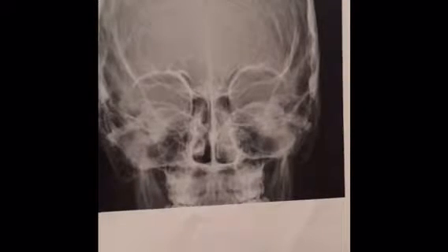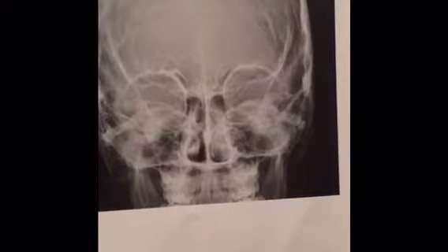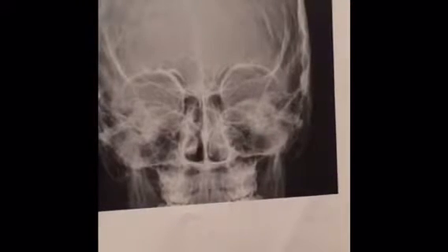The petrous ridge symmetric on both sides. The mid-sagittal plane of the head aligned with the long axis of the collimated field. You're going to have the petrous ridge lying in the lower third of the orbit.